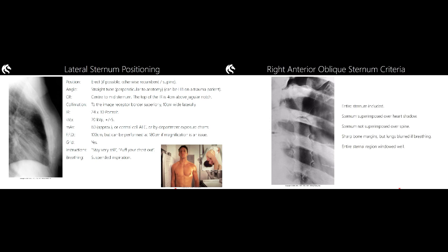Now, one of the most important things that you can do for a sternum is to collimate well. Patients' sternums, generally speaking, curve out as they come inferiorly and then dip back in a bit when we get to the xiphoid. But some patients have got a concavity, some a really prominent convexity, some it's very straight. So palpate the sternum and palpate the length of the sternum, okay? Because I want you to not just know the depth, but to know the curvature of the patient's sternum. The best and most important rule of sternal radiography is this: collimate tightly. Assess your patient's ability to comply, assess their ability to stay still, and if they're a compliant patient, please collimate, particularly with larger chested patients with lots of soft tissue, because that soft tissue is going to compromise the image.